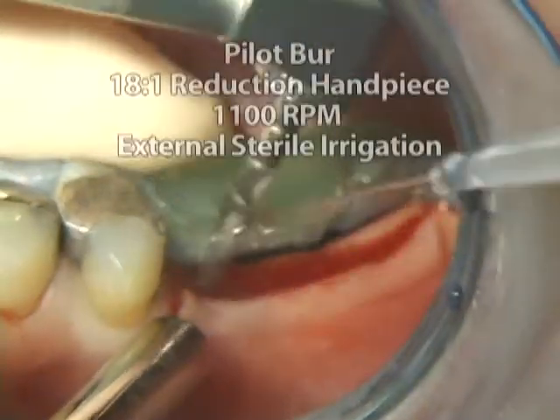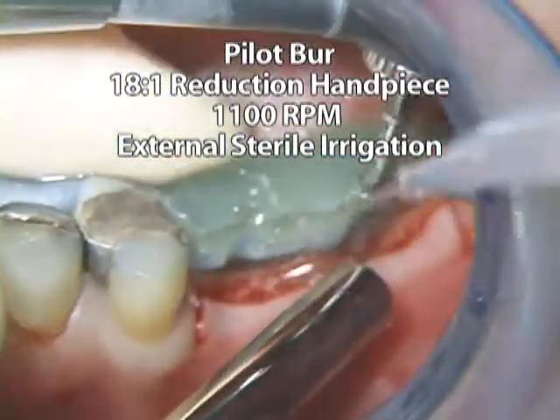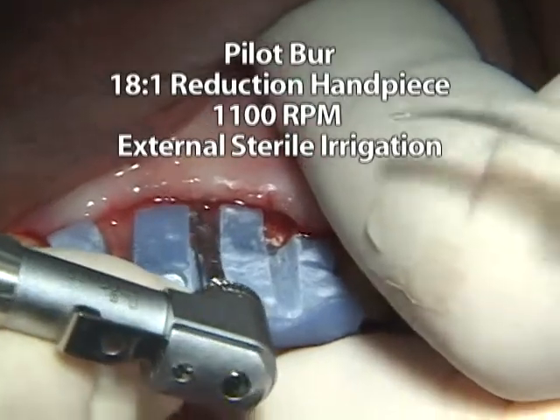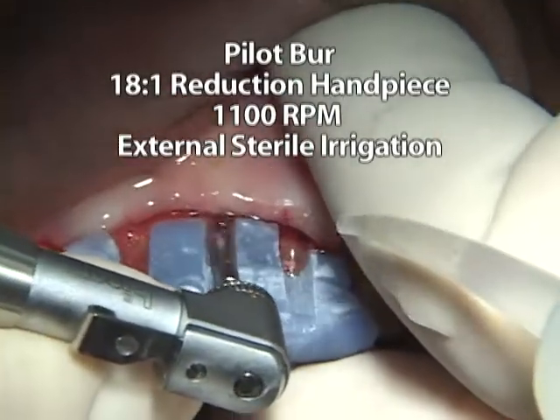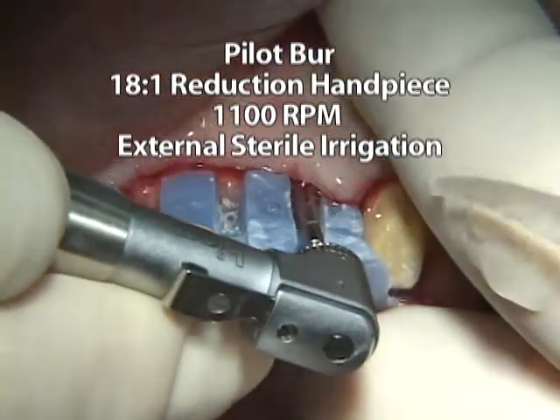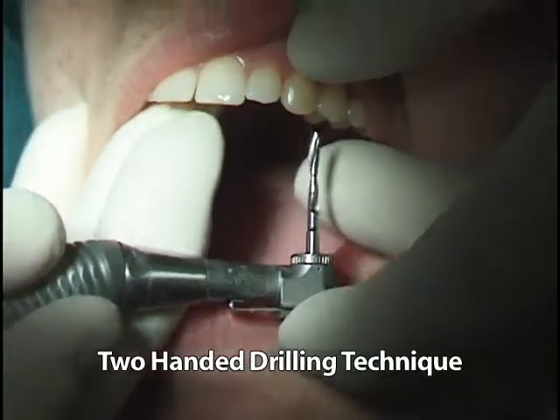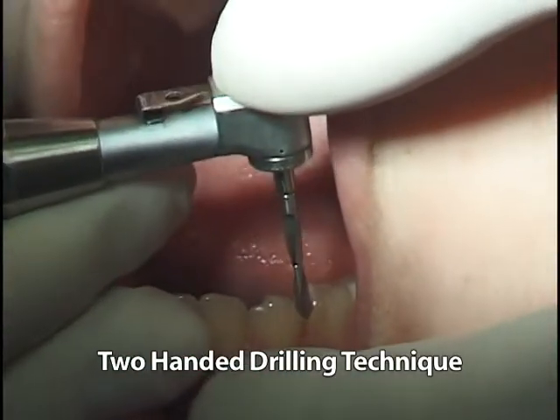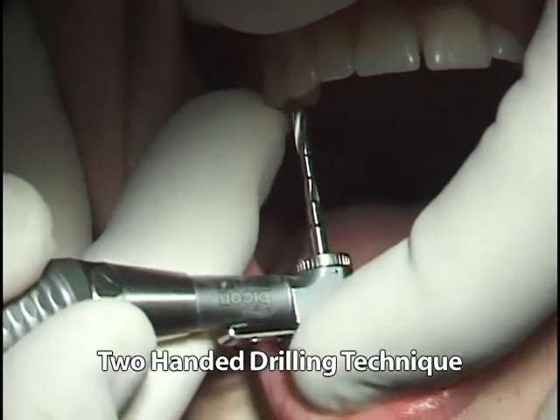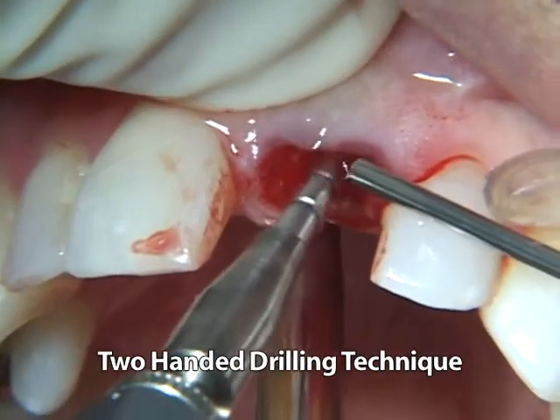Using a surgical template as a guide with a 2 mm pilot drill in an 18:1 reduction handpiece, the initial penetration for the pilot osteotomy is made completely through the crestal cortex, with the drill rotating at approximately 1100 RPM with external sterile irrigation. It is advisable to use a two-handed drilling technique, where one hand guides the drill while the other hand applies the apical drilling pressure.